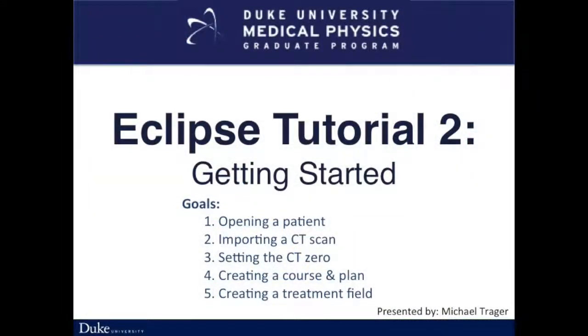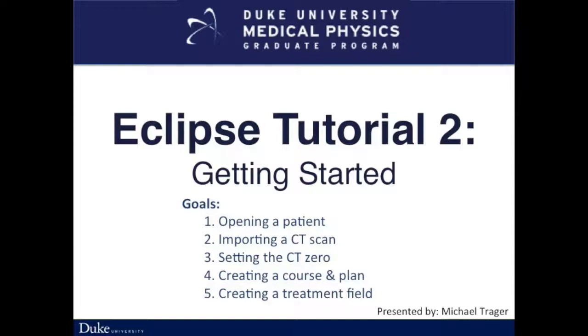This is the second video of the Eclipse tutorial series, Getting Started. In this video, I will discuss the basics in starting your first treatment plan. This includes opening a patient, importing a CT scan, setting the CT zero, creating a course and plan, and creating a treatment field.